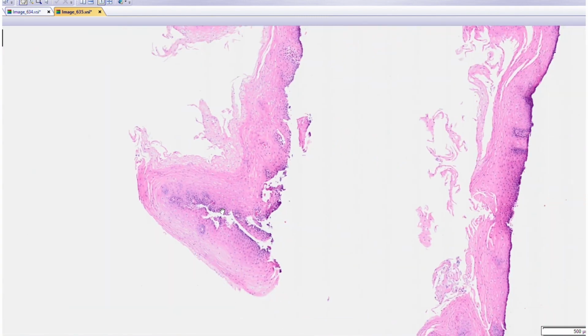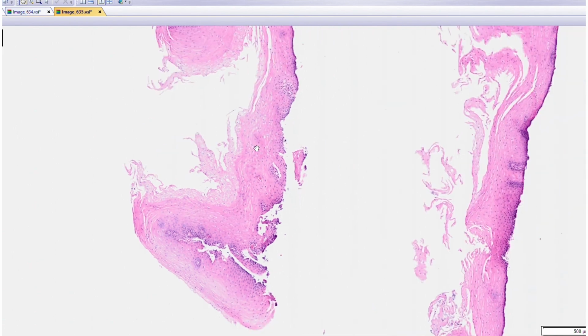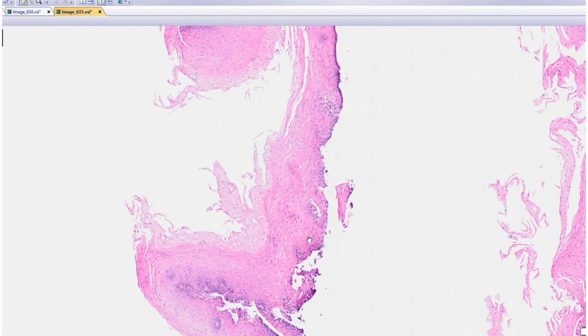And overall, there's a thickness here. This is an extra layer. So one might think about something called glycogenic acanthosis, which is technically a hyperplasia in which another tissue layer develops, and they don't know exactly what causes it, maybe some infectious process. However, in this case, it's not just another tissue layer.